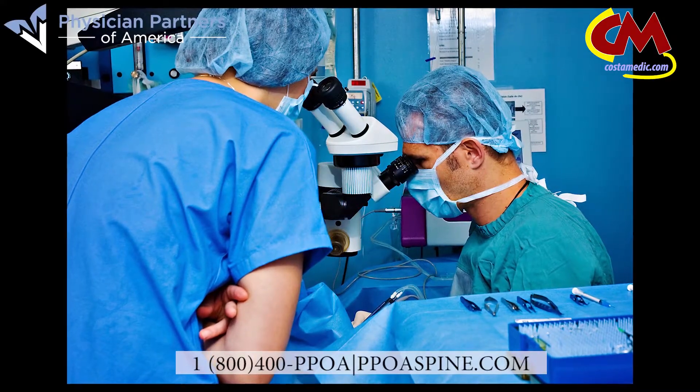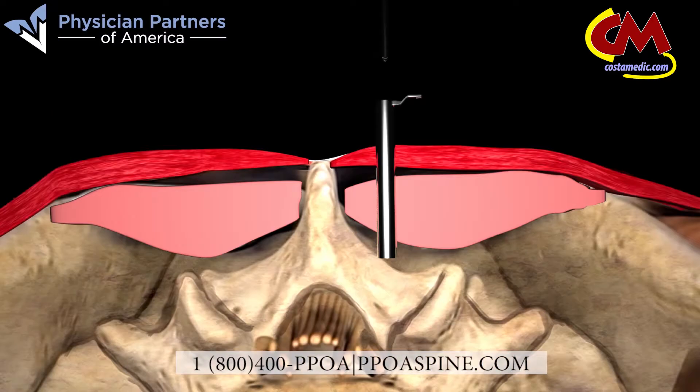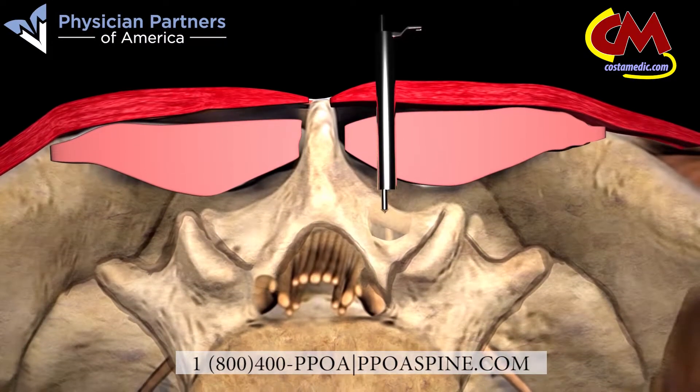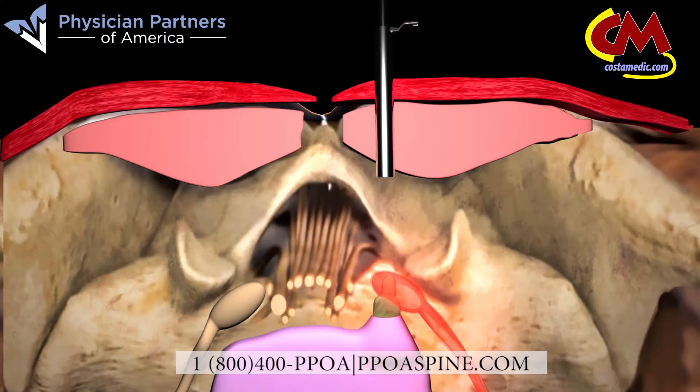Magnification allows your physician to directly view the treated area through the small tube. Precision instruments, including a Kerrison rongeur, are used to remove a small section of the lamina. This gives the physician access to the herniated disc needing repair. Once a precise amount of the disc is removed and the nerve is no longer being compressed, a laser is used to cauterize the edge of the disc.